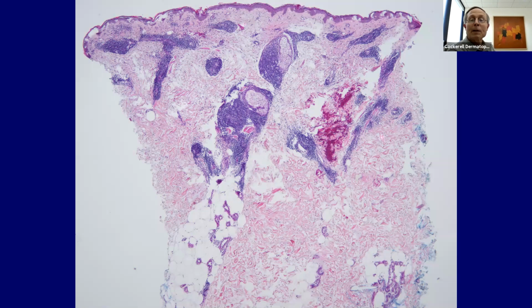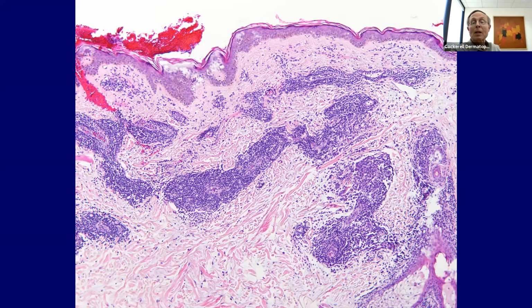Okay, superficial and deep infiltrate. At low power, you can tell these are lymphocytes. So at this point, all your third years, you shouldn't even have to go to higher magnification to come up with a differential diagnosis. So you think of the lymphocytic infiltrates here. Classic ones, they talk about the 5 lymphocytic infiltrates, but you can expand that to about 8 or 9. You should expand it a little bit because there are several other things that can give you a lymphocytic infiltrate like this. So when you get a lymphocytic infiltrate, then you say, well, what are some of the options, things that you look at to be more specific in the diagnosis?